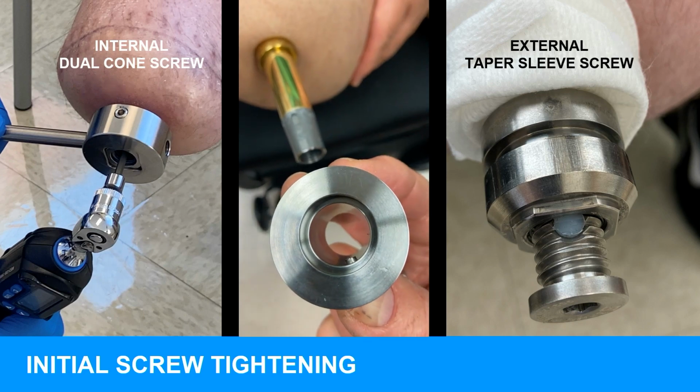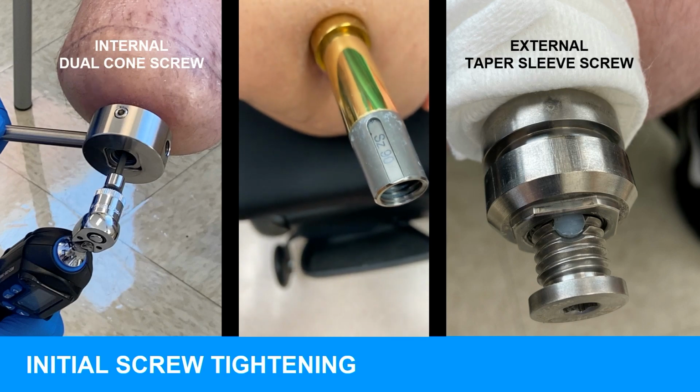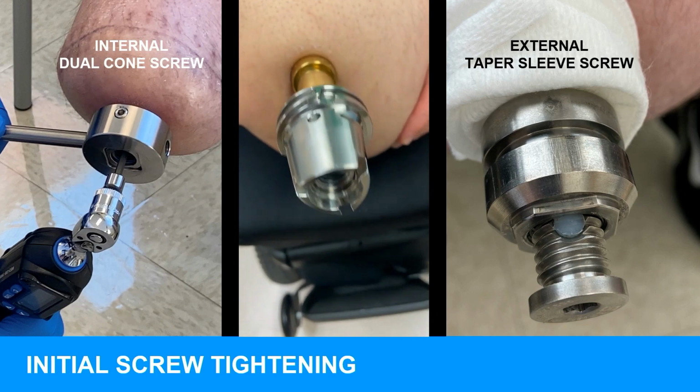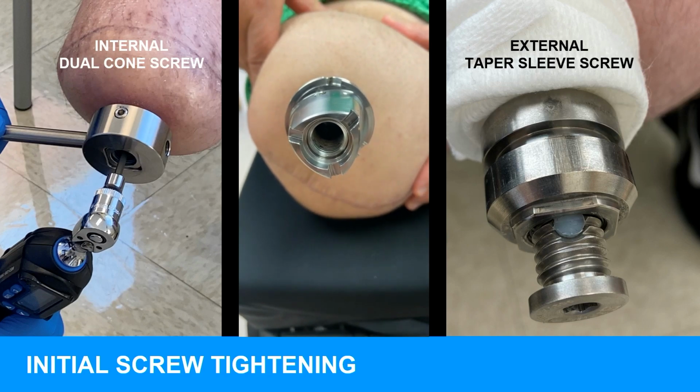There's a dual cone, one of several dual cones, and that pin slides right along the channel. I'm sorry, there's a taper sleeve sliding onto the dual cone, and then we attach the dual cone with a taper sleeve screw. I said it backwards. We attach the taper sleeve with a taper sleeve screw.